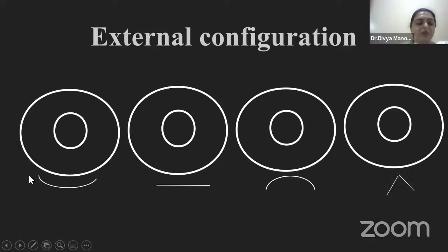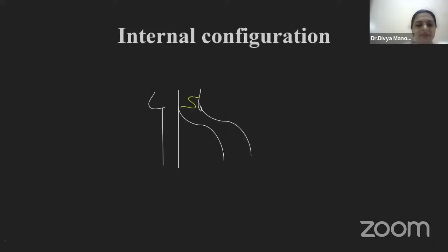When the chord length is less, then your astigmatism is going to be less. That's why the frown incision, the inverted chevron or the V incision gives us less astigmatism, and these are the most preferred incisions. The other beauty of these incisions is that the ends of the incision are far away from the limbus, thereby creating a better tunnel. As for internal configuration, it's good to have a 3-planar incision.